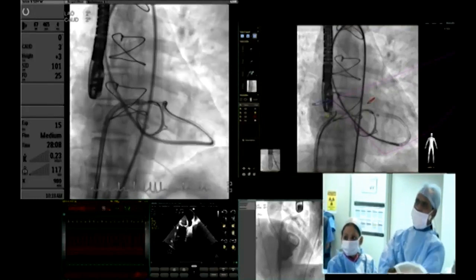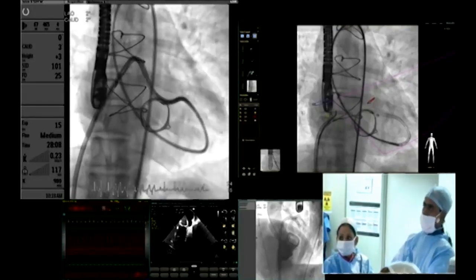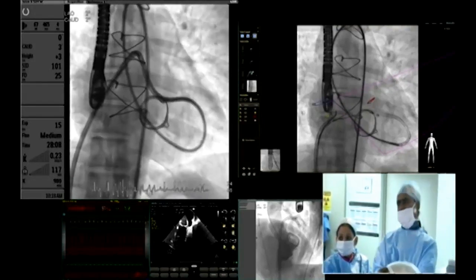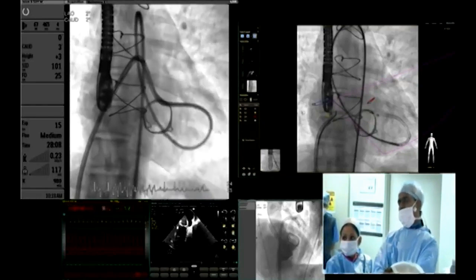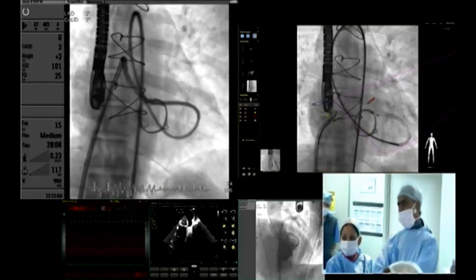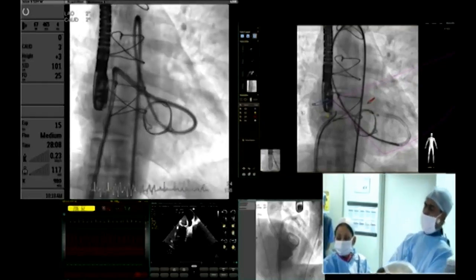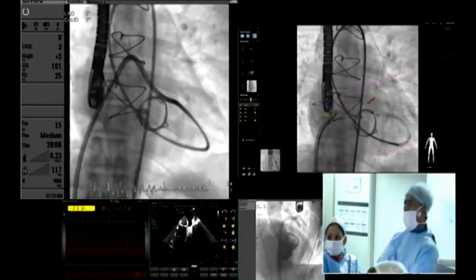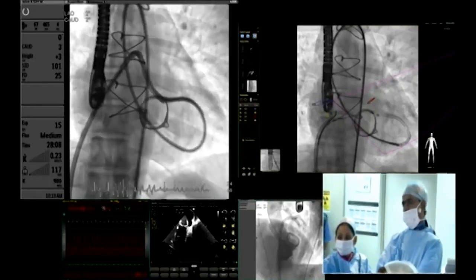Now this is the shuttle sheath. We are actually kissing each other — an 8 French shuttle sheath now across the arterial route and an 8.5 Agilis across the venous route.